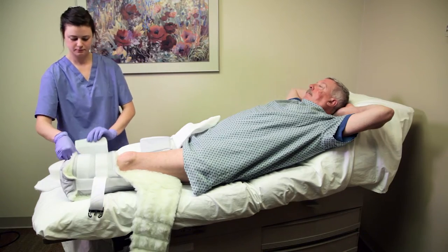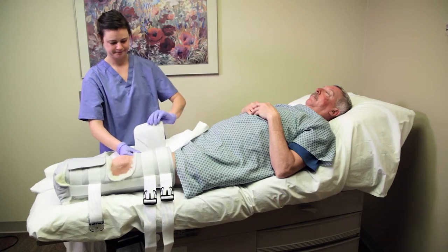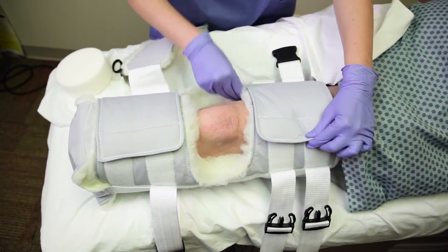Once the optimal circumference is achieved, secure the flaps over the residual limb. Next, secure the proximal straps over the patient's thigh.